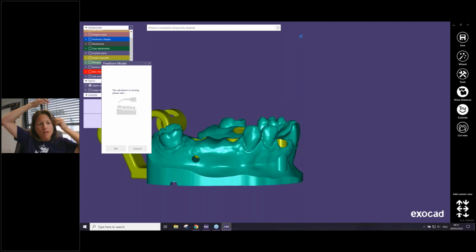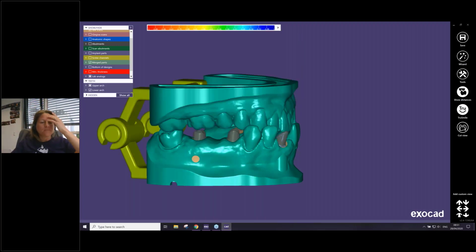What I would recommend, just for your information, but for attendees, is that it makes sense in this 21st century to avoid these Geller models. Forget it. It's all very old analog school.